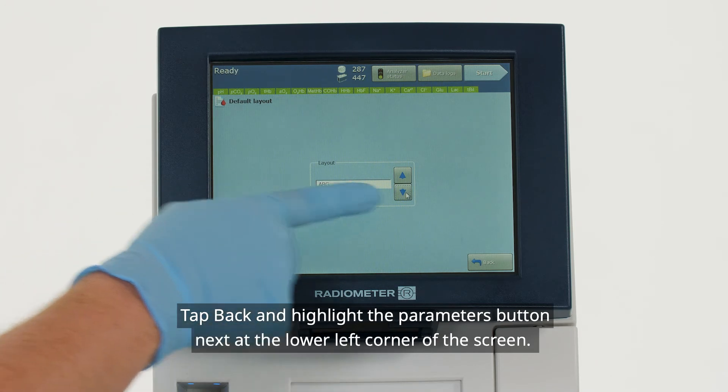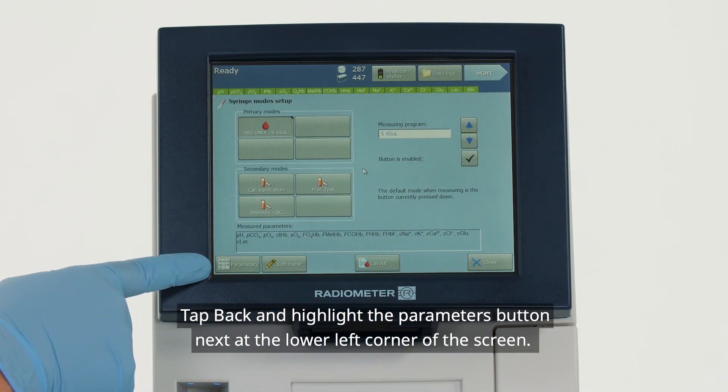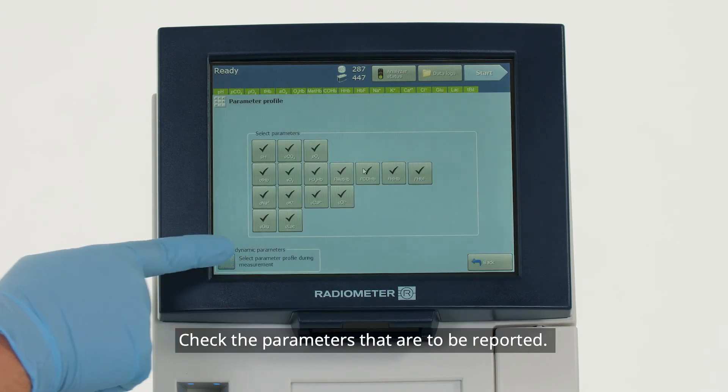Tap back and highlight the Parameters button at the lower left corner of the screen. Check the parameters that are to be reported.